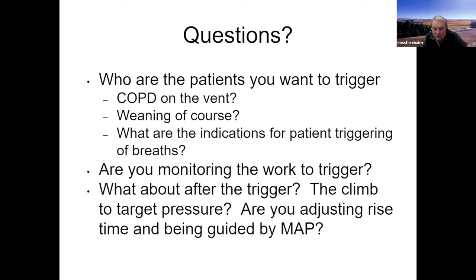So, Steve, our practice would be to leave the trigger on all the time, and would use flow triggering as a default for all patients. That's what I think Jeff would be the same. I think that's standard throughout New Zealand and Australia now, to use the flow trigger on all the patients, based on perhaps poor knowledge, but an understanding that this is more sensitive than pressure triggering. And that would be on most of the time. I think it'd be very rare for us to turn the trigger off at all on our patients. Jeff, is that correct? Yeah.